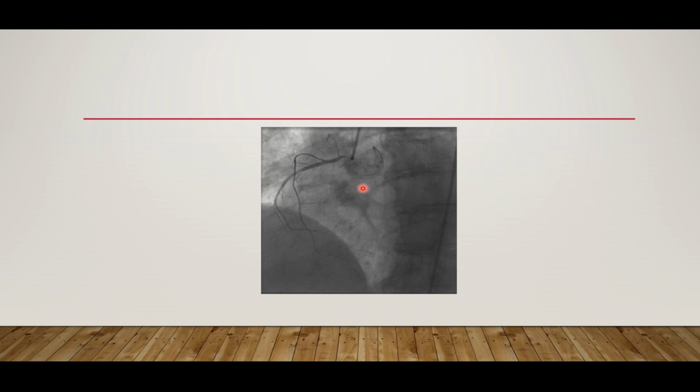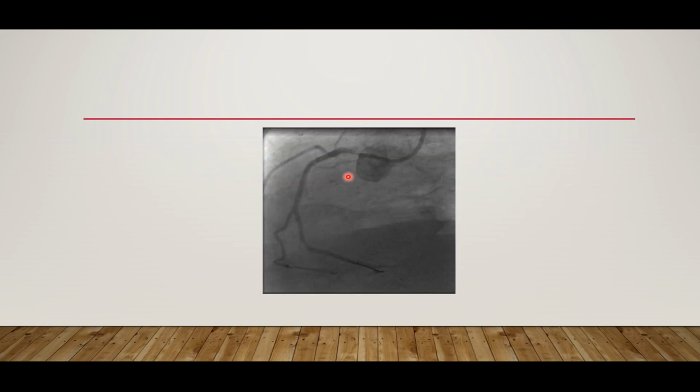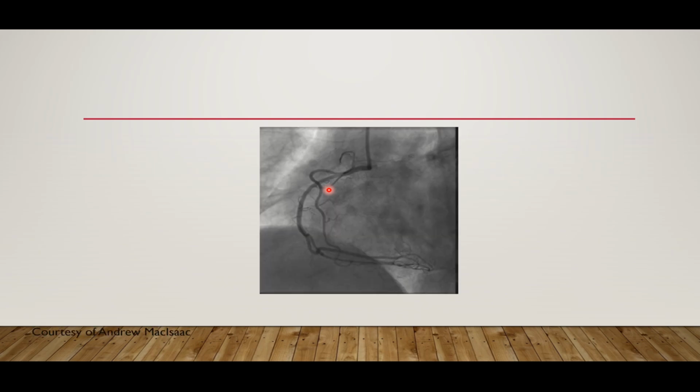Let's look at this case from the American Board Review. There is a significant ostial lesion of the RCA, stenting, but unfortunately, they missed the ostium. And this is confirmed by IVUS, by the way. That's why he had to insert another stent to really cover the ostium, and this is the final image. So, knowing where the real ostium is is very important.